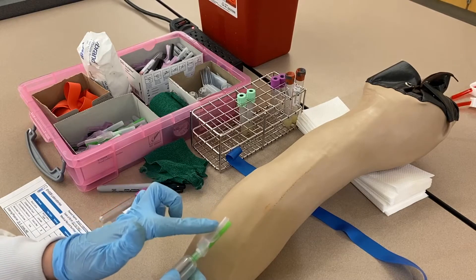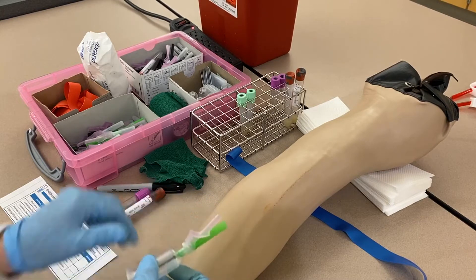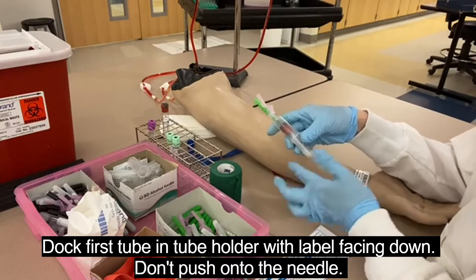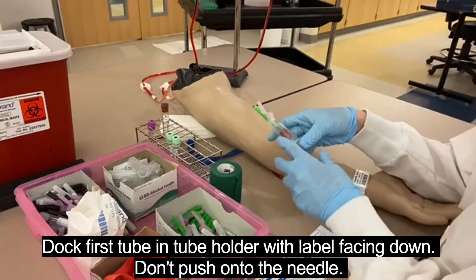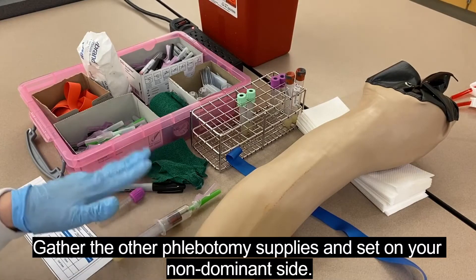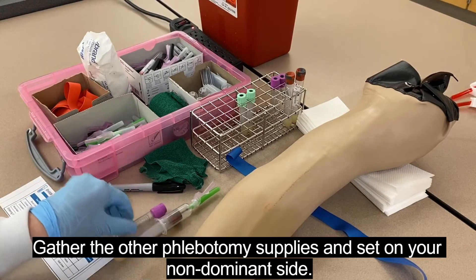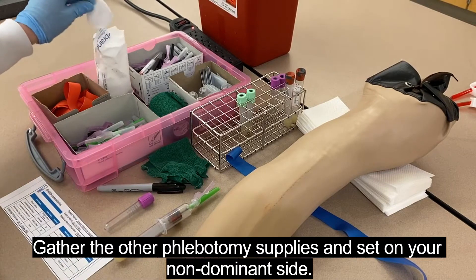The safety device, when pulled back, should align so the bevel is up. I'm going to place my tube in there but not push it onto the needle yet, because that will cause the tube to lose its vacuum. I have it ready with the label facing down so I can see the tube filling. For phlebotomy, your supplies should be set off to the side of your non-dominant hand, because your dominant hand will be holding the needle. I've got my tubes and I need some gauze.